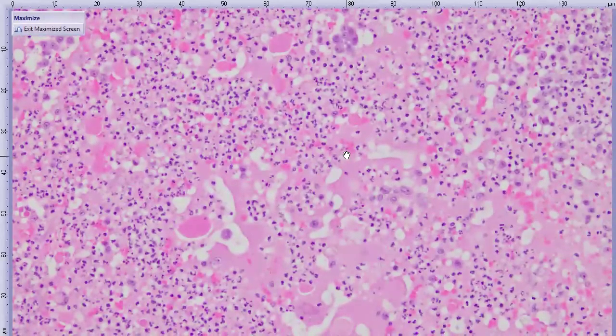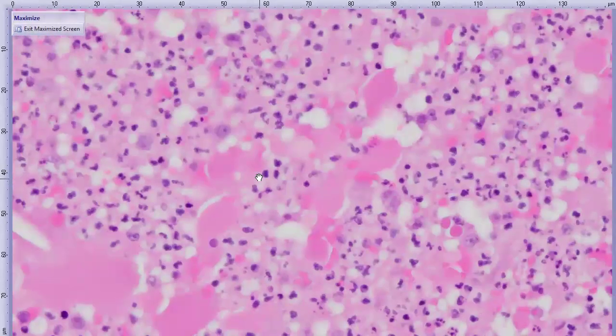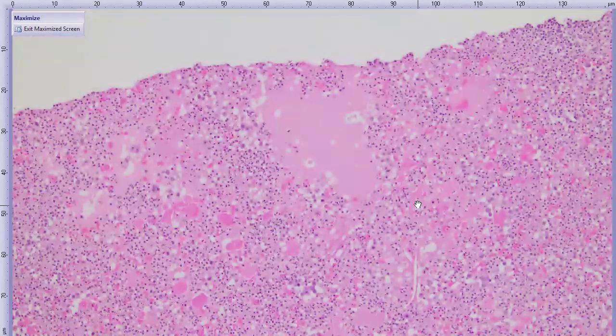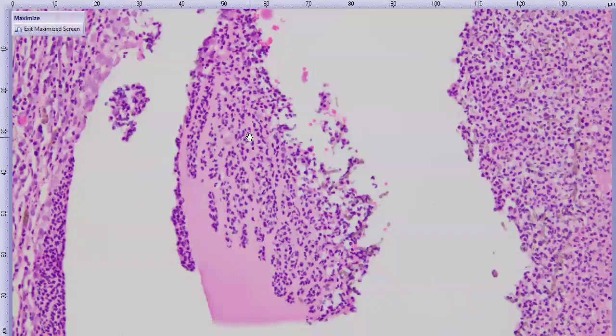And it's a mixed inflammatory cell population here. So we've got a lot of neutrophils in here, these little segmented nuclei. We've got some macrophages, and there's a lot of this bright eosinophilic globular stuff in here, which is actually coming from the lens. So if we travel back forward, follow this cellular infiltrate around to the front here. Oh, this was the piece that I wanted. We see that our lens capsule is discontinuous, and it is also being infiltrated by this inflammatory infiltrate. So we've got this lovely fraying here.